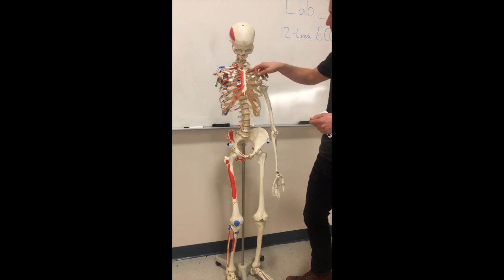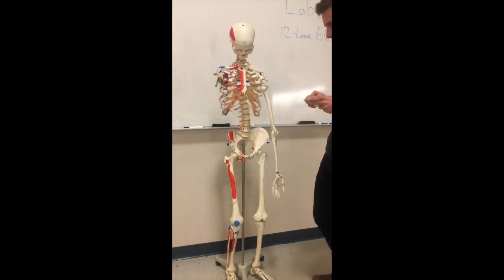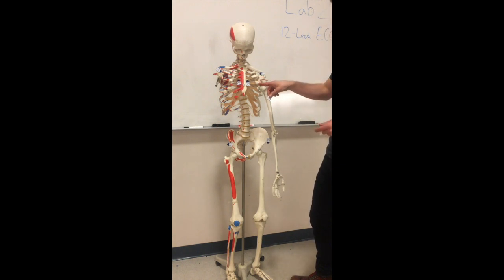V2 is in the 4th intercostal space on the left side of the sternum. Okay, so now we have V1 and V2. Like I said, we're going to skip V3 and V4. The easiest way to find V4 is to go on the nipple line to the 5th intercostal space. Okay, so the nipple line down to the 5th intercostal space and place V4 there.